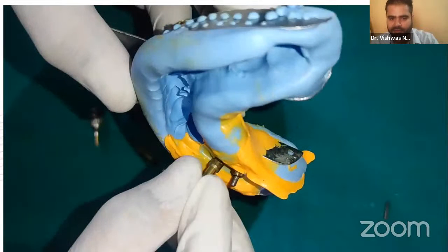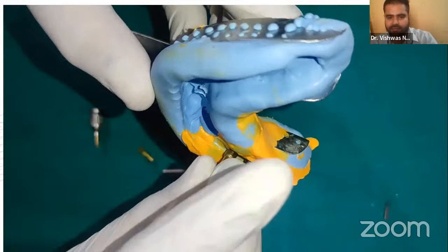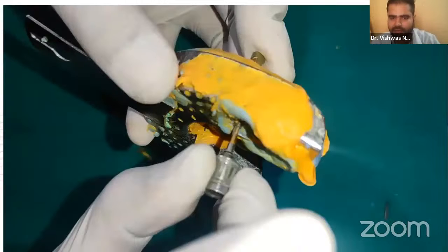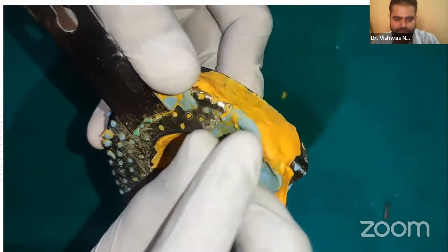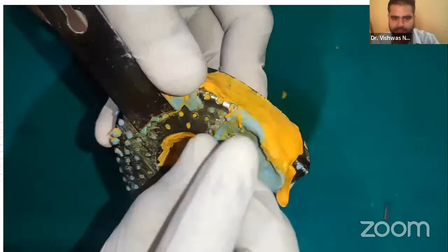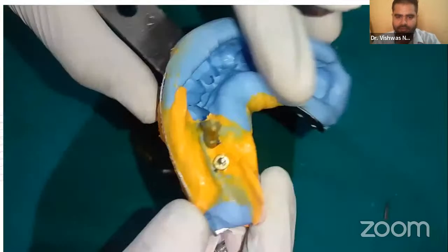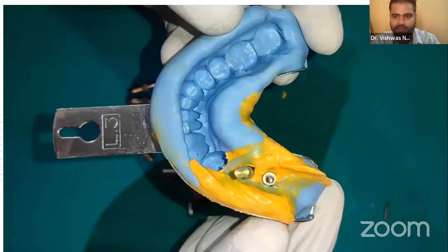Once it is properly seated, we secure it from the back with the help of the driver. And this is how you apply an analog to an open tray system.